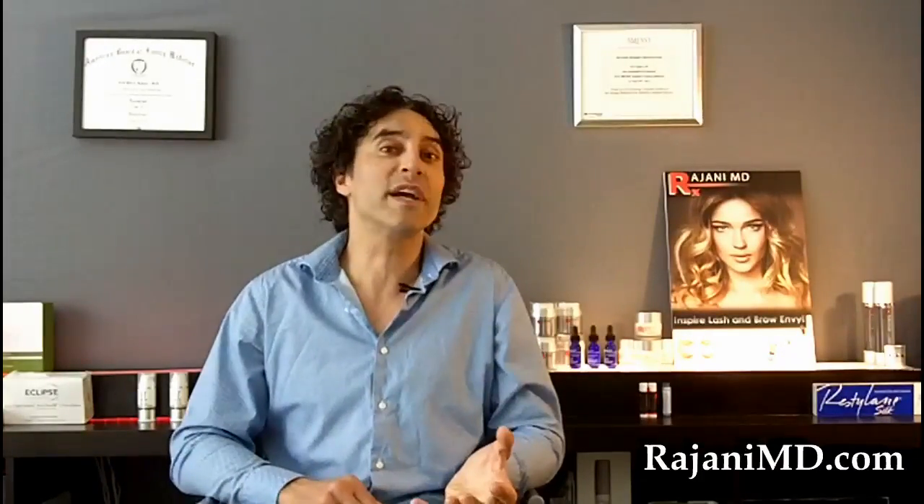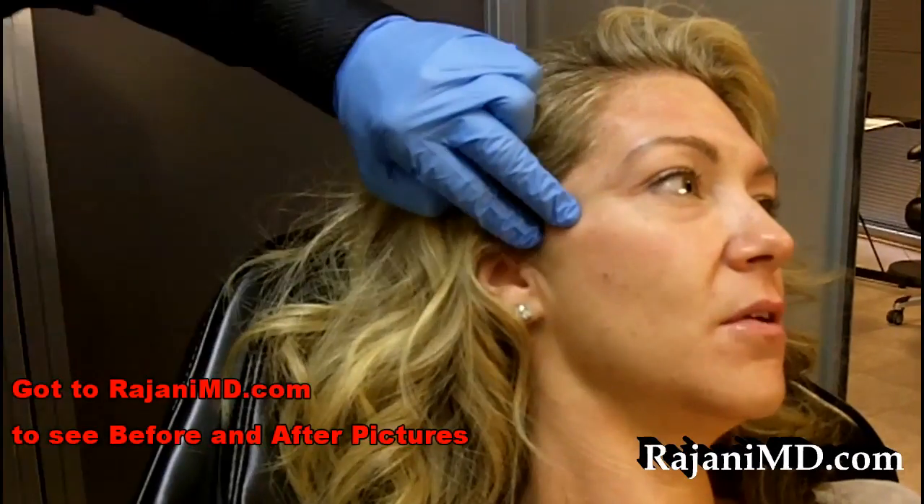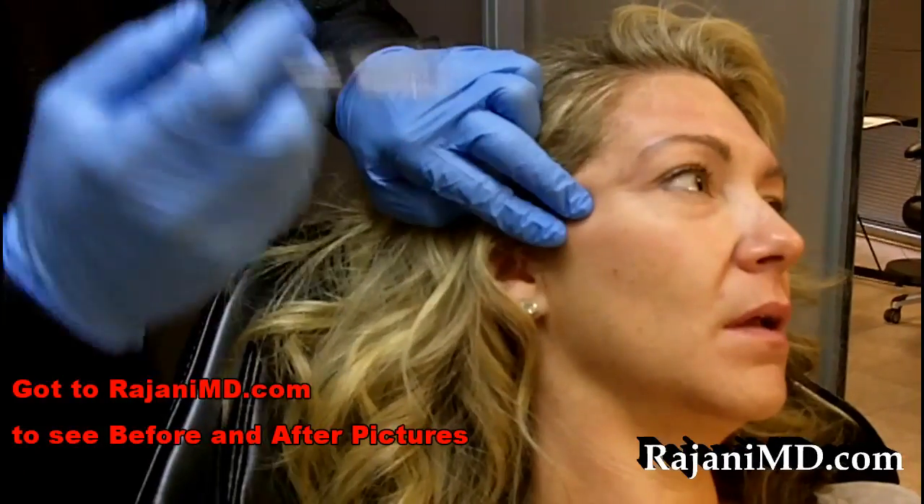Let's go to the video — you can watch a procedure being done and see how quickly it can be done. It's a relatively safe area to inject and patients love the results. Micro cannula technique to augment the high lateral cheek — this is one of the most common areas and patients love this.